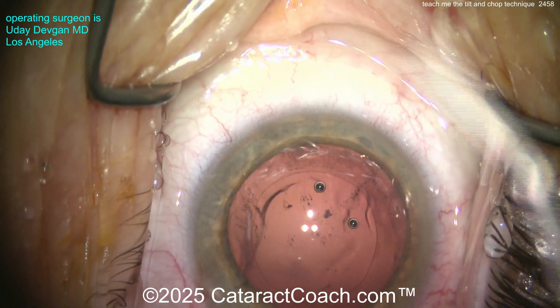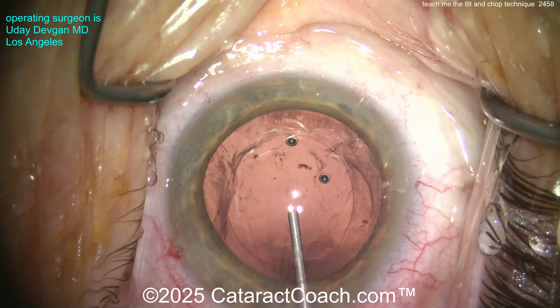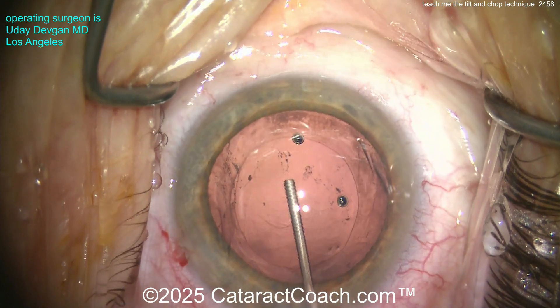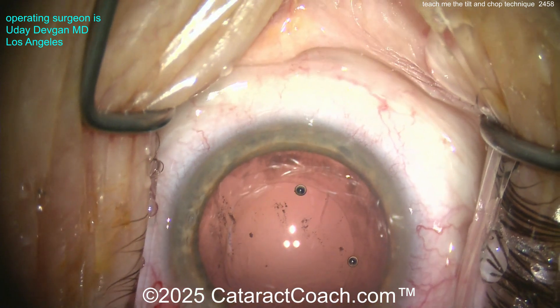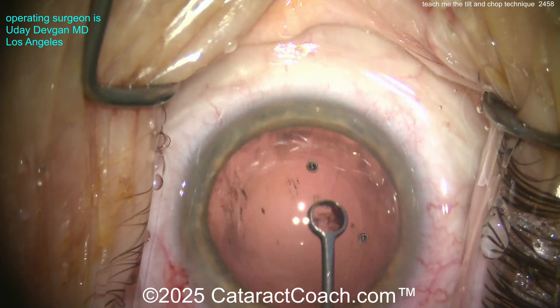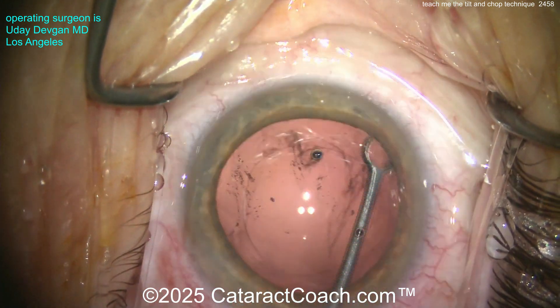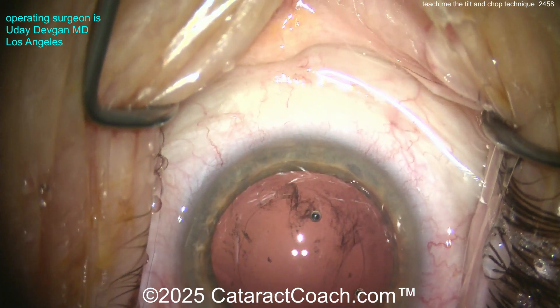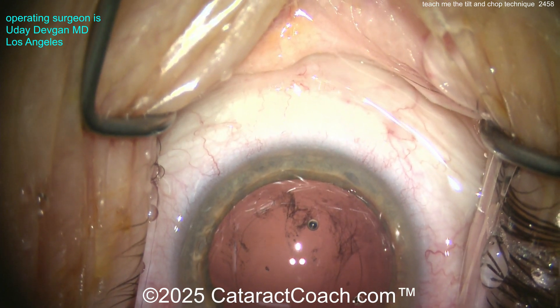Let's polish the bag up a little bit too, so we can put our cohesive viscoelastic inside the eye — nice and easy, get a good fill of the capsular bag. Now does it make a difference to polish the capsule? I don't really know; studies have gone one way or the other. But it makes me happy, so I'm going to do it. It looks pretty. We've cleaned up and polished the undersurface of the anterior capsular rim.